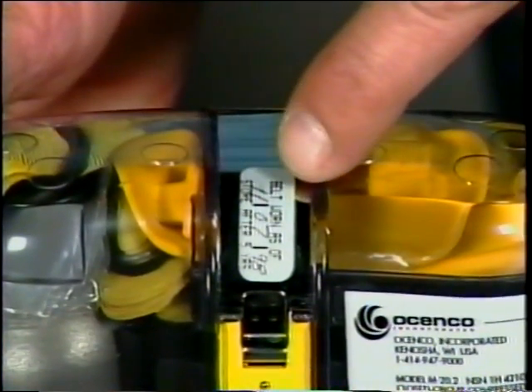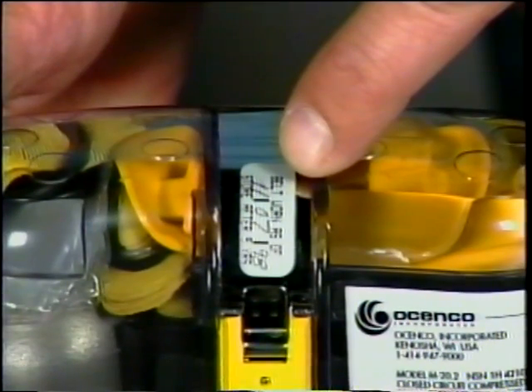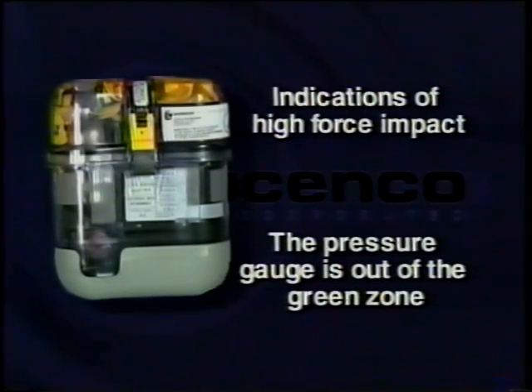Follow TICOM guidance for bulkhead and belt-worn EEBD donning procedures. If any indications of high force impact are observed, or if the pressure gauge is out of the green zone, remove the Osinko EEBD from service.